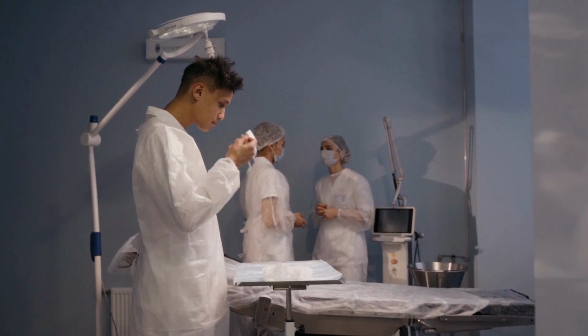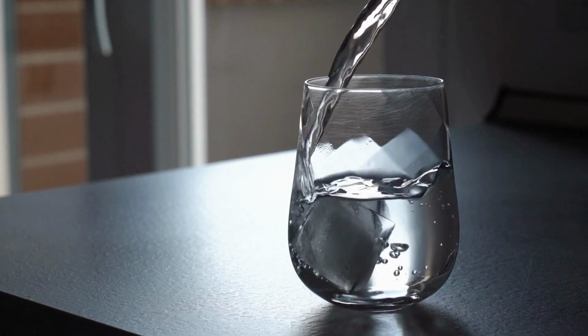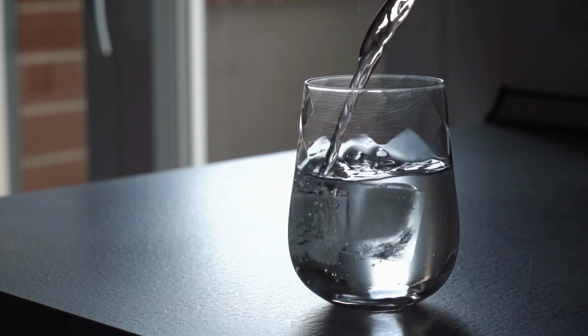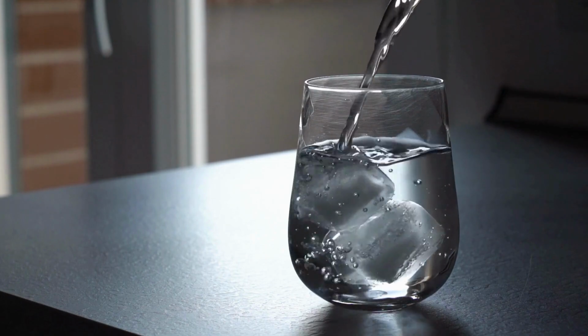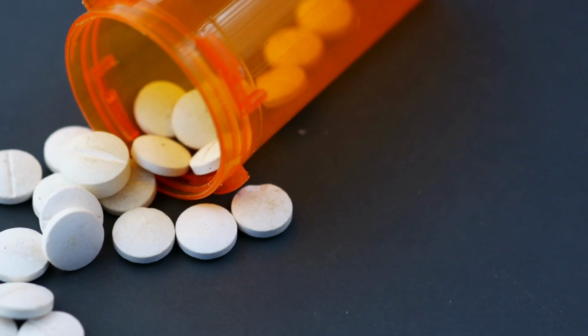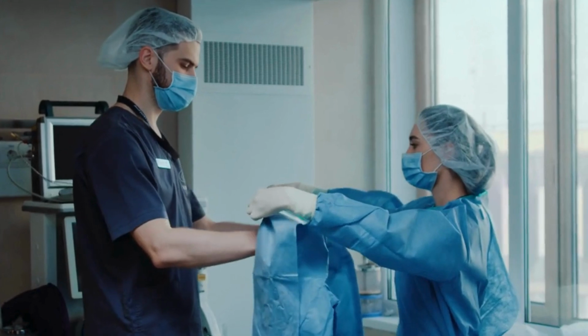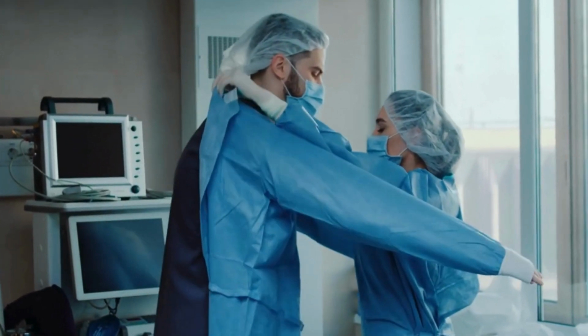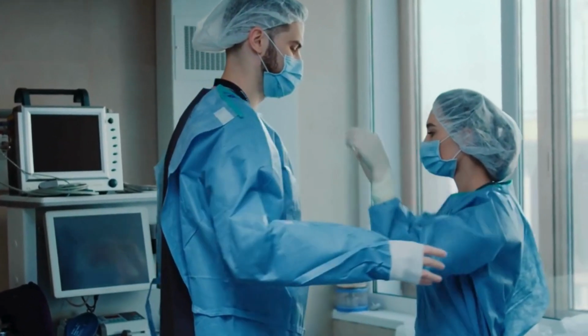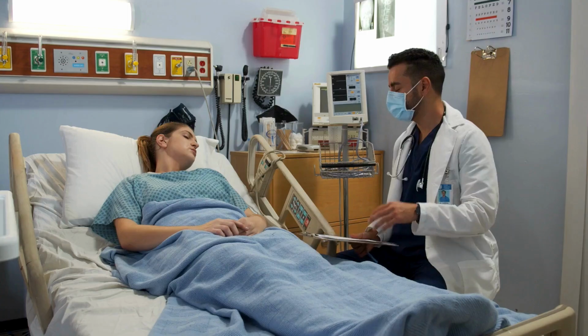A few important actions are necessary before the procedure. Hydration: ensure the patient drinks enough water to arrive with a full bladder. Avoiding medications: some medications might affect bladder function, so review the patient's current medications. The uroflowmetry procedure. During the procedure, the patient urinates into a specialized device that measures the speed and volume of urine flow. It's a non-invasive test that typically only takes a few minutes to complete.